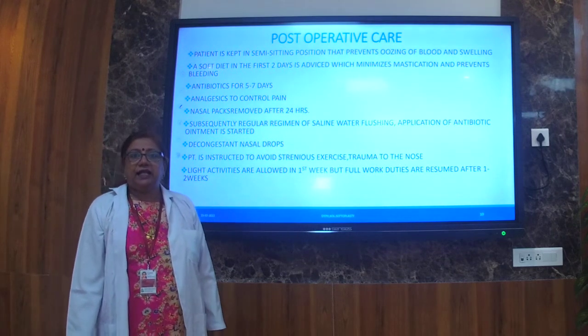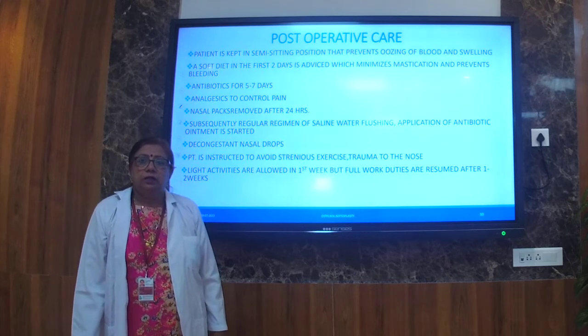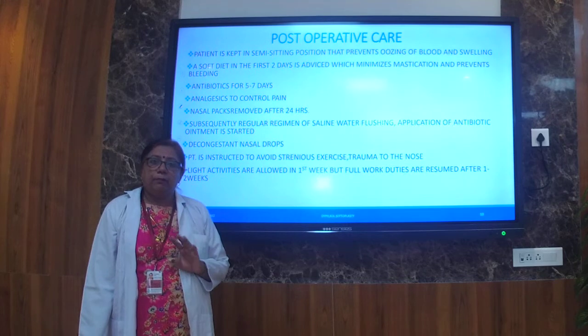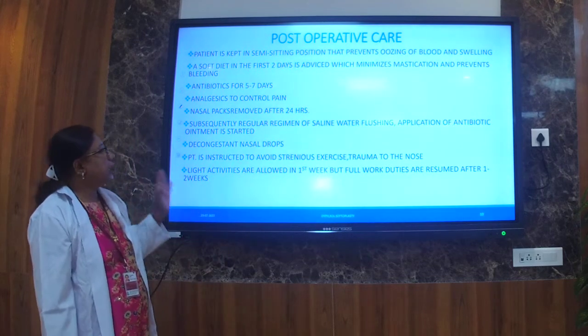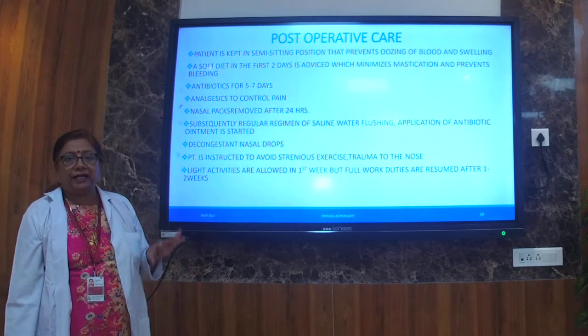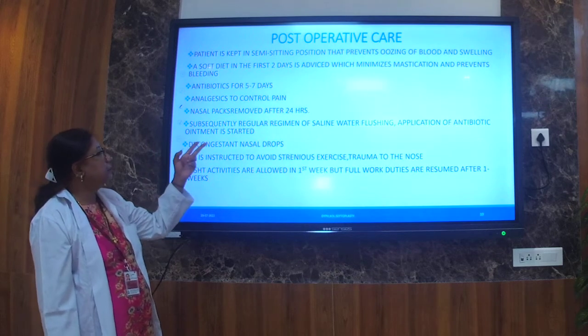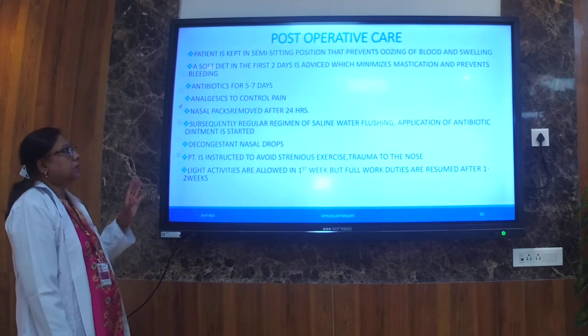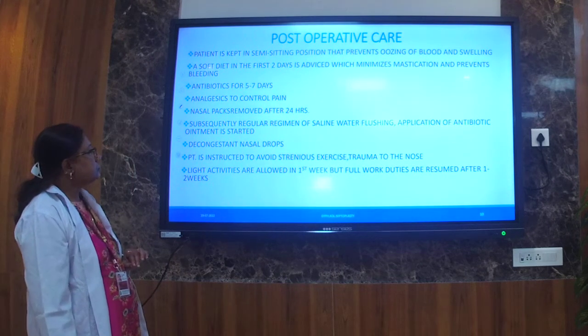If there is a need, the pack can be kept up to 48 hours. But it is always our practice to remove the pack within 24 hours. So this will finish our procedure.